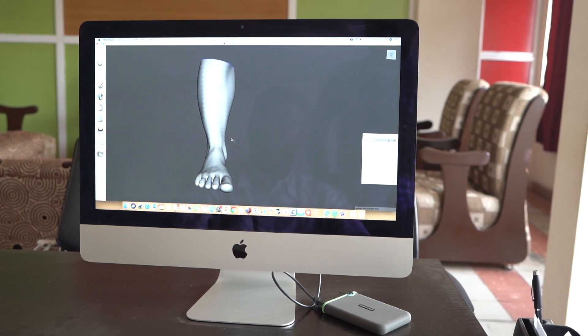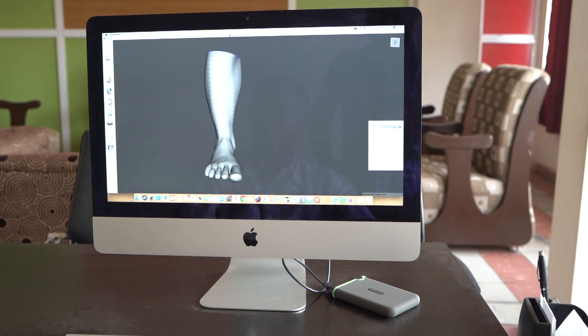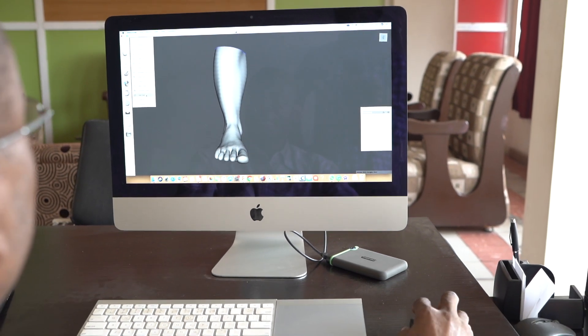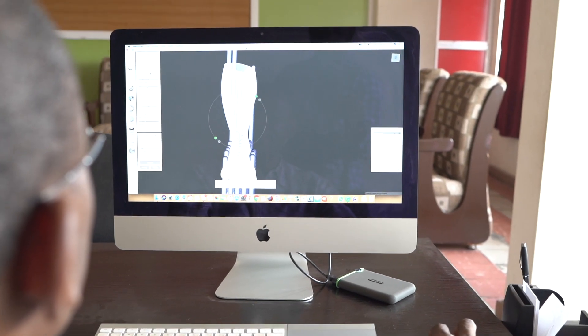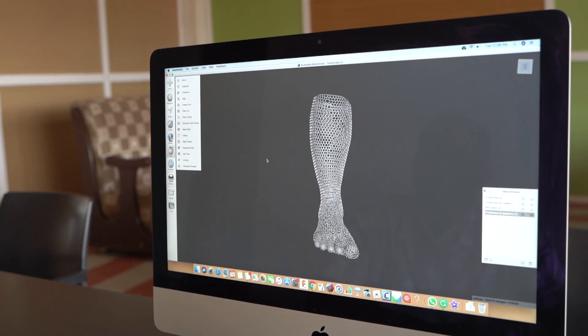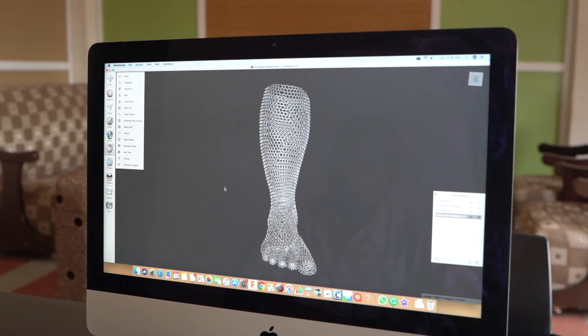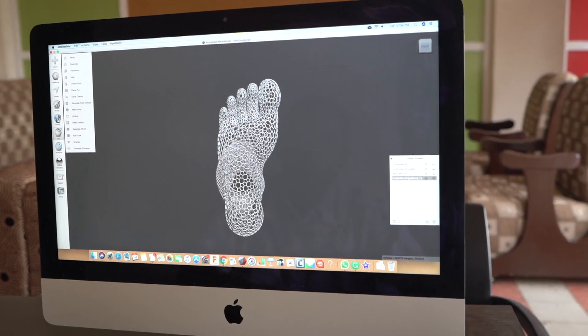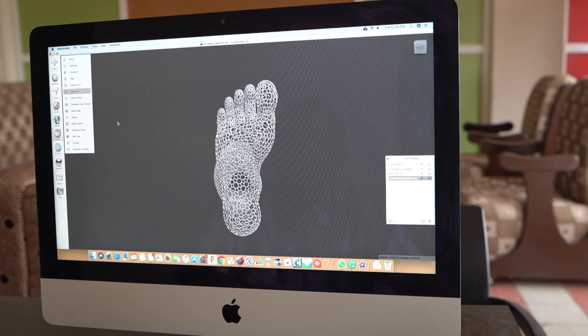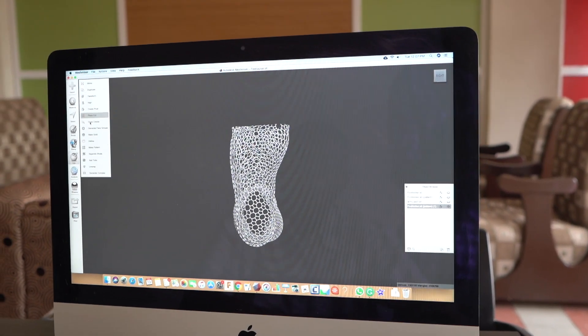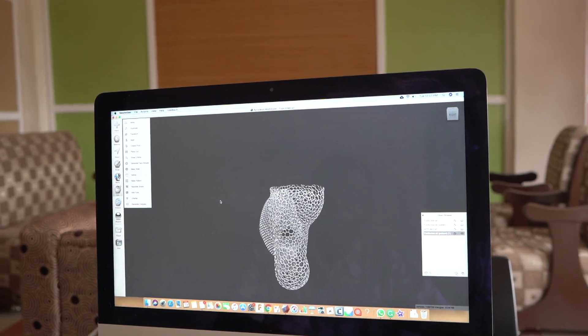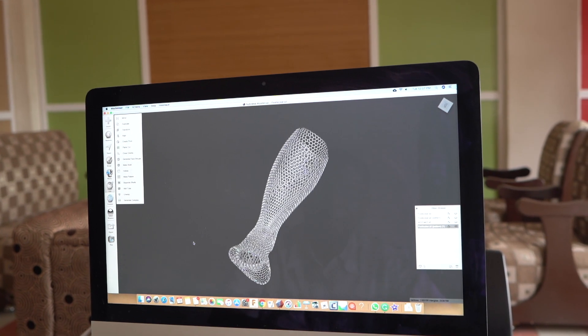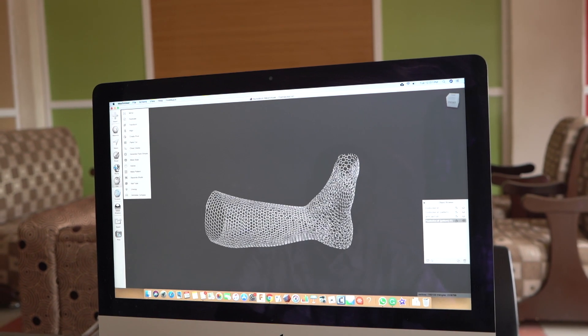I'd like to show you the process for getting another type of design. We're using the leg scan model for this. Now, I'm going to make hole patterns on this. We've created the mesh, and the next thing we're going to do is get the toes off. This is the final product—this is what we send to the printer.